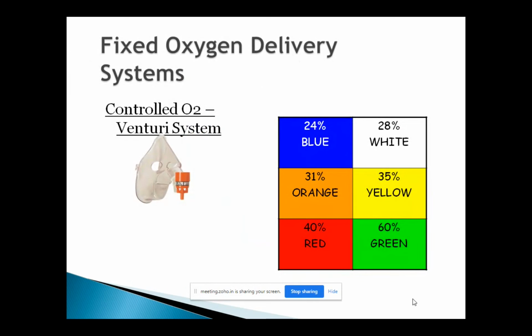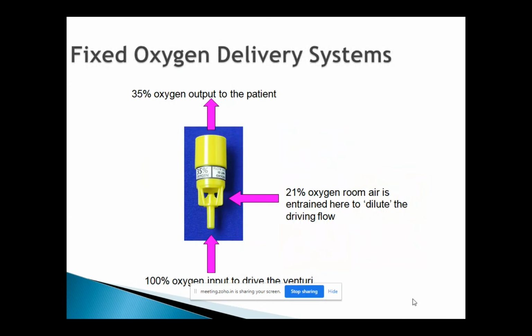So it's important, it's very simple, it's very much color coded, you can't go wrong, and the manufacturer instruction will be on the side of the valve. So 24% will be 2 liters, 28% will be 4 liters, orange maybe 6, yellow 8, red maybe 10 or 12. As I said, different manufacturers have different instructions, but I would strongly recommend you follow the instruction on the valve. It will be printed very clearly how many liters of oxygen you should give the patient to deliver a specific oxygen concentration.